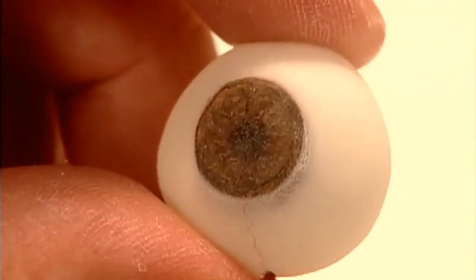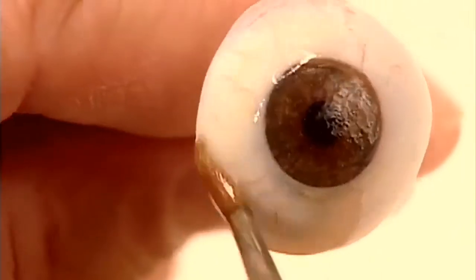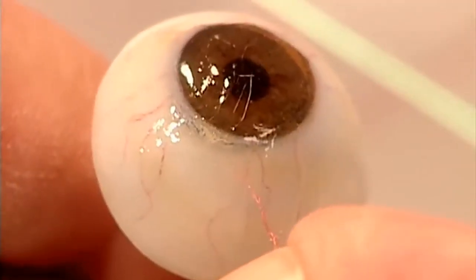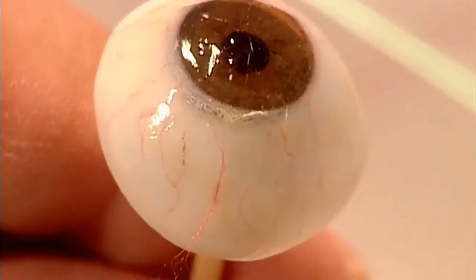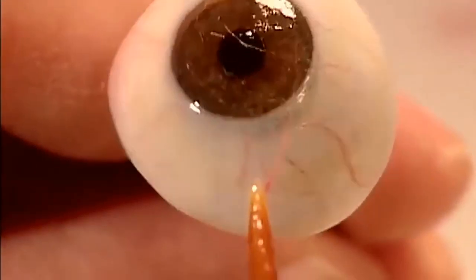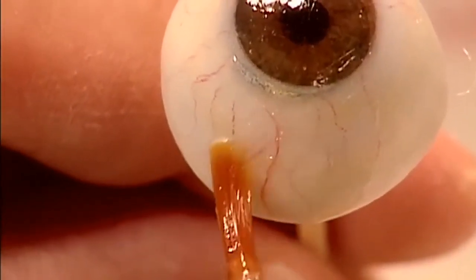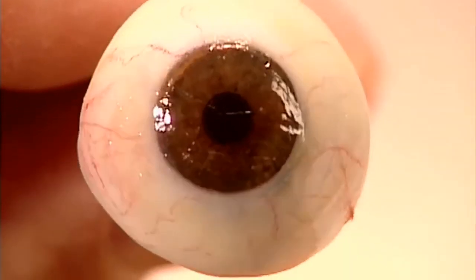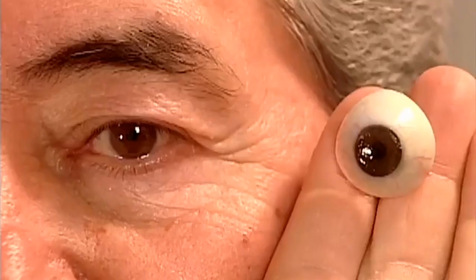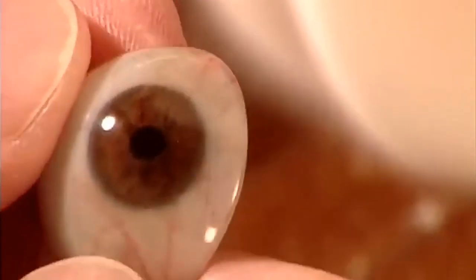Then, using hard-colouring pencils, they add finishing touches to the iris and draw blood vessels. They label the eye with the patient's initials, then apply an acrylic coating to seal the pencil marks. To create veins with some dimension, they use the same acrylic coating to stick on some delicate silk threads. Once they're satisfied, the artificial eye is a perfect match. They seal the artwork with another acrylic coating. Once that cures, they polish the eye to a shine with a cotton wheel.